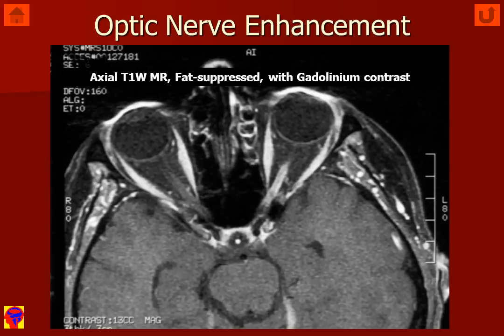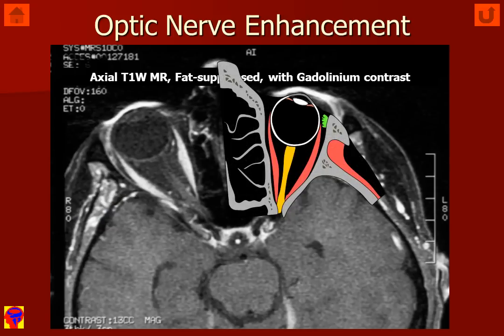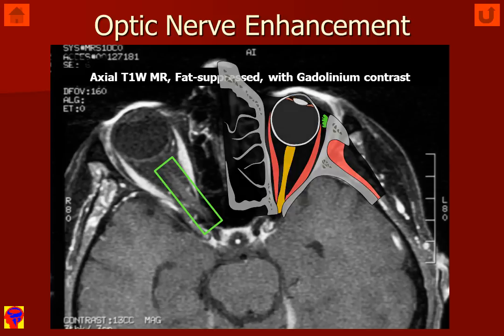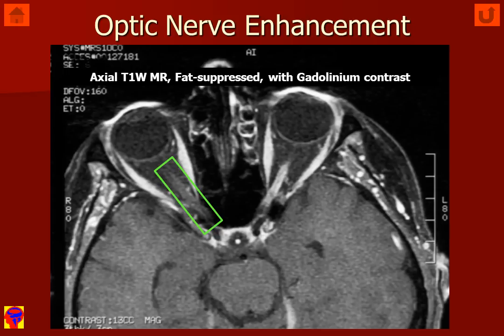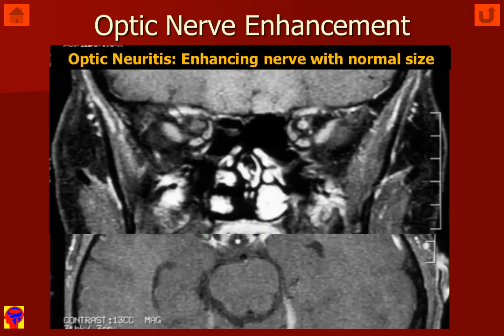If we look again at this axial T1-weighted MR, fat-suppressed with gadolinium enhancement, and we imagine what we're seeing from reference to the diagram, we can see in the patient's normal right orbit inside the green rectangle that the normal optic nerve does not enhance. However, in the patient's left orbit, we can see abnormal enhancement of the optic nerve, but the nerve itself is not enlarged. This is most consistent with an optic neuritis.